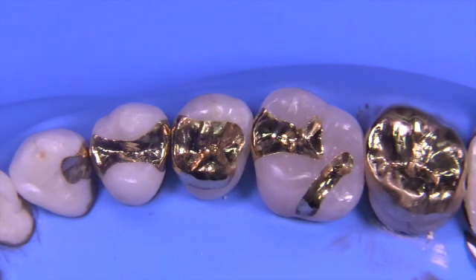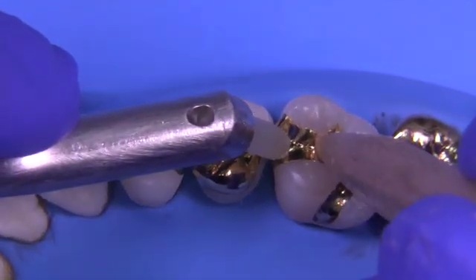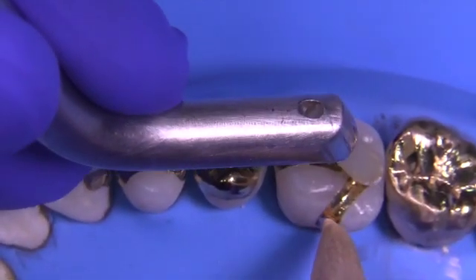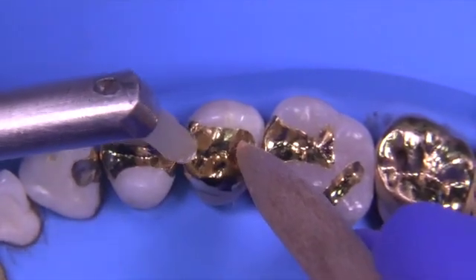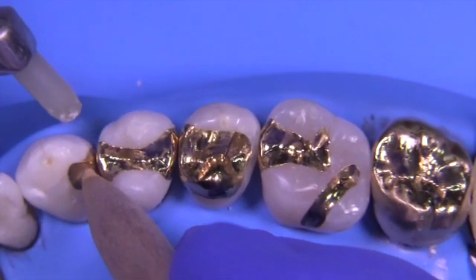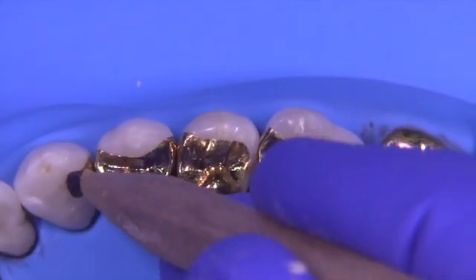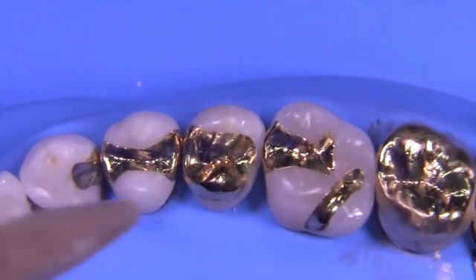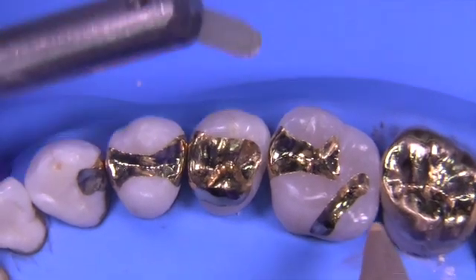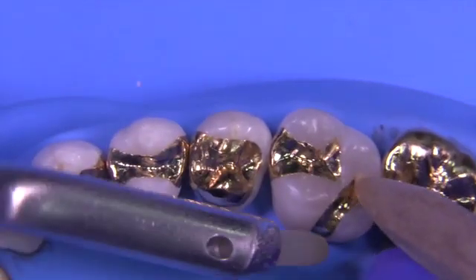These are just tried in — I haven't done any finishing yet and haven't cemented them yet — and you can see the margins are somewhat irregular. The reason they're irregular is because KOIS does not polish the margins, believing they should only be polished once. If you're going to polish them in the mouth, you polish them at that time. Pre-polish everything else, and maybe polish margins that are not accessible, but leave them unfinished.